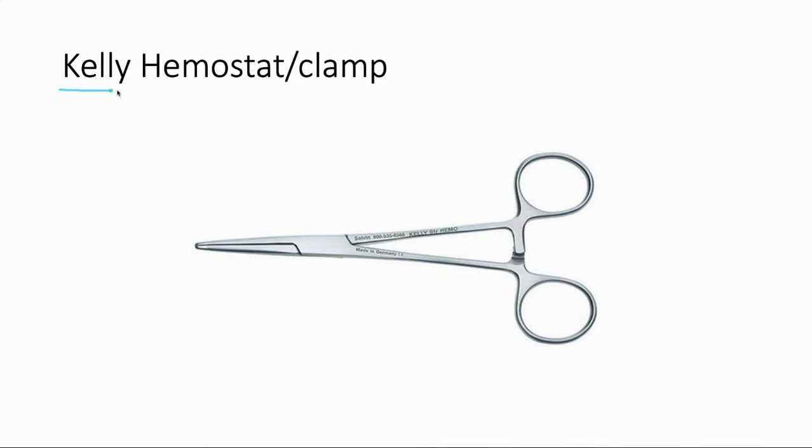This is a Kelly hemostat — kind of your all-purpose clamp. You can use it for blunt dissection and clamping vessels. That's actually what hemostat stands for; it can be used to stop bleeding, although we don't use it for that much anymore. It looks kind of like a needle driver, but once again doesn't have that coarse friction in the jaws.